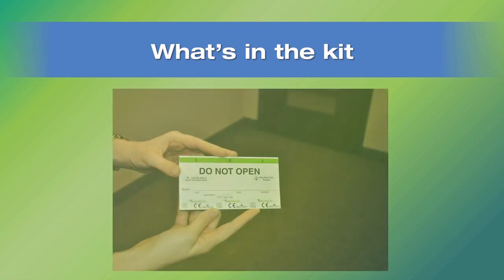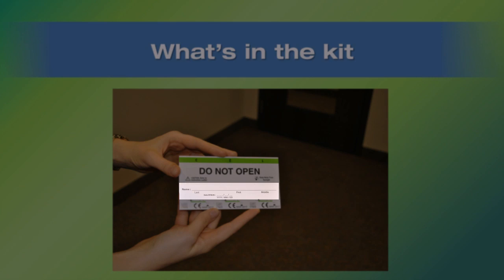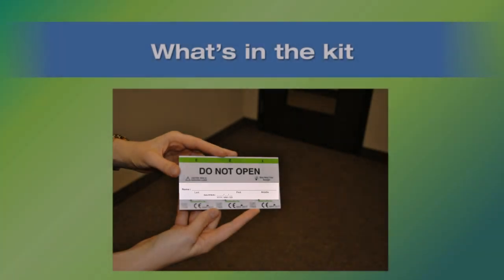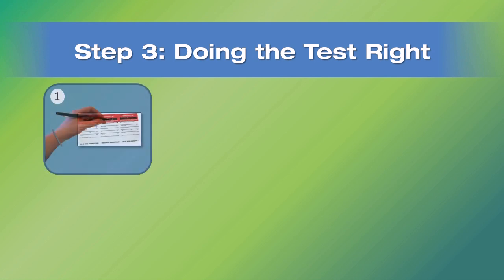Before you start, please make sure the front of the kit is labeled correctly. It has to have your name and date of birth. The lab will not examine kits that aren't labeled properly, and you won't want to go through all of this for nothing. When writing your name, please make sure it's written exactly the same way as it is printed on the requisition that came with the kit. Write the name and date on your first sample.